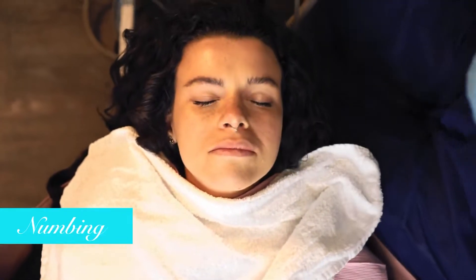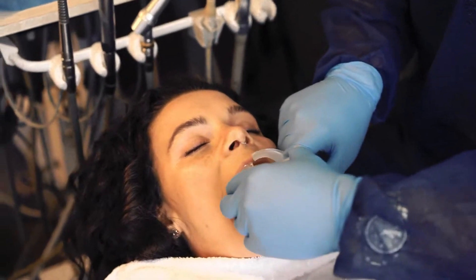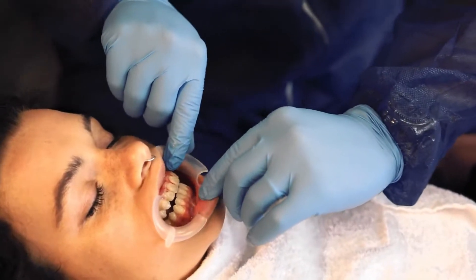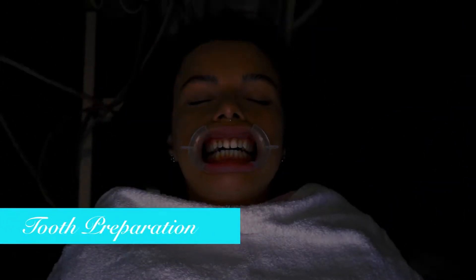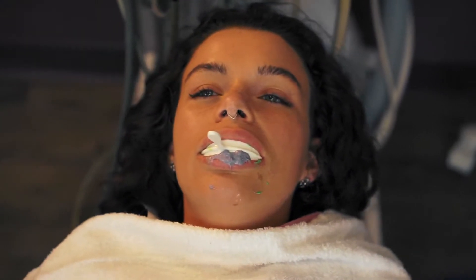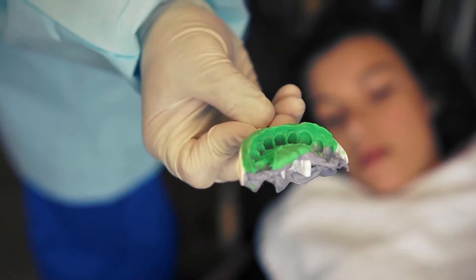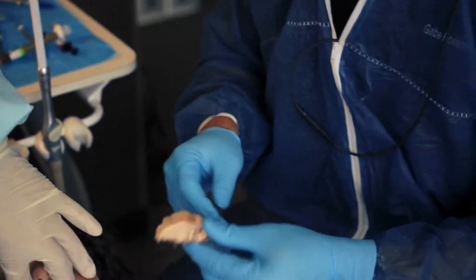You're done, okay? You feel it? A little bit — a little stretch. Bite down. Are you cool like this? Great. As long as this impression comes out super clean, there's nothing I don't like about that — that is perfection. We have an injection molding and then this is going to harden on her teeth. We'll take it off in a bit.